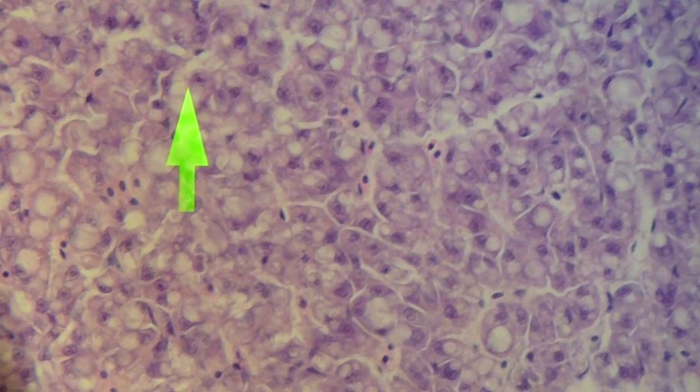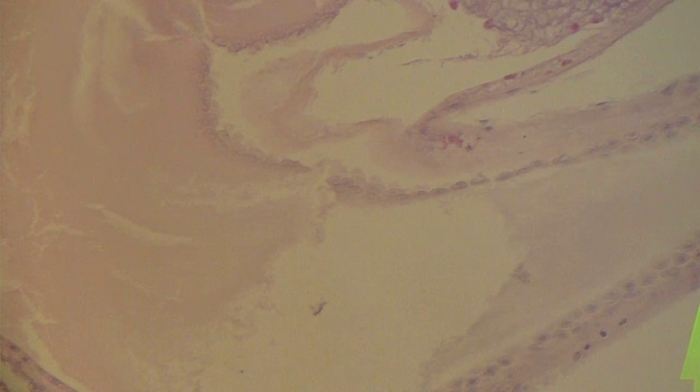If we have a look at the gallbladder, zooming towards the south-east, you can see that the gallbladder is quite distended and contains quite a lot of bile. This supports that the fish has not eaten probably in the last week or so.